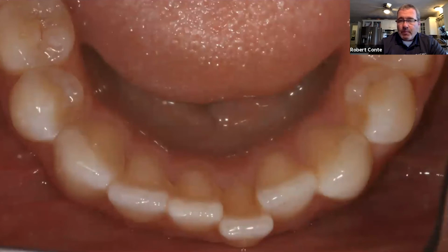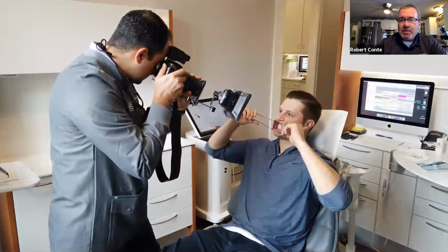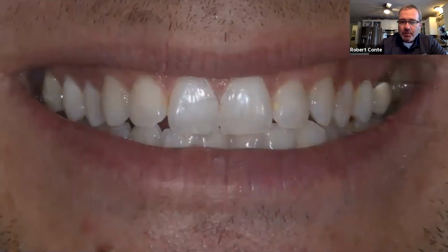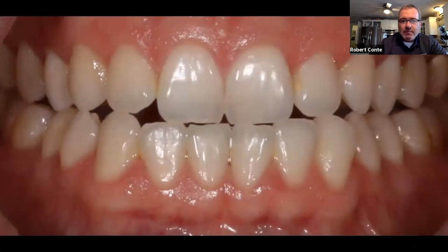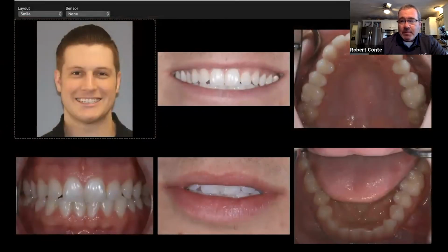Right? We talk about it in hygiene. How much easier it would be to clean if your teeth were straighter. This is a perfect opportunity for aligner therapy. It's your classic middle-aged relapsed patient. Maybe they've got some wear. But hey, let's just put the teeth in the right place. So photographs of every patient, really quick to do. Delegate it to your staff. Now your full smile shots, cheeks retracted, at rest. And let's talk about your smile.